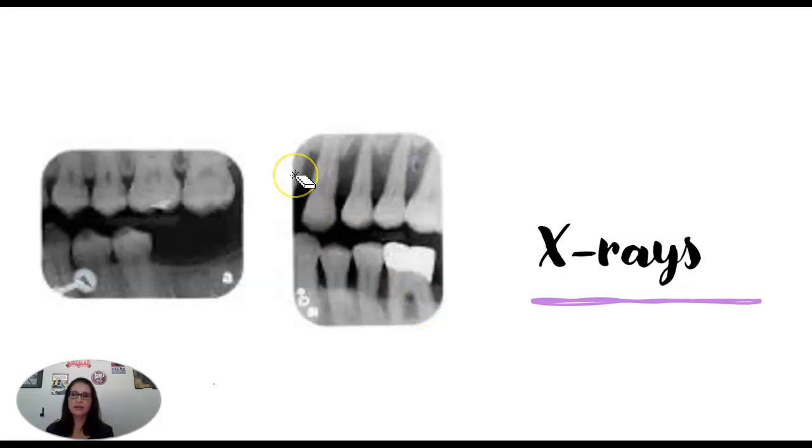As we come up, the maxillary teeth are a lot worse than the mandibular teeth. We can clearly see bone level here on this canine. Not much holding this first premolar in, not much holding this second premolar in, and it's a little hard to determine what's going on here without having a molar vertical bite wing. So this tooth and this tooth more than likely have mobilities of 3, probably 7 or 8 pocket depth, depending on where we're probing. And more than likely these teeth, possibly this tooth, and maybe this tooth are going to have to be extracted.